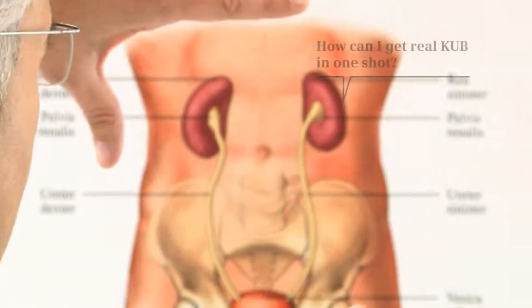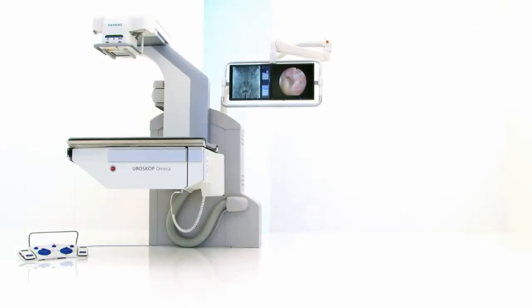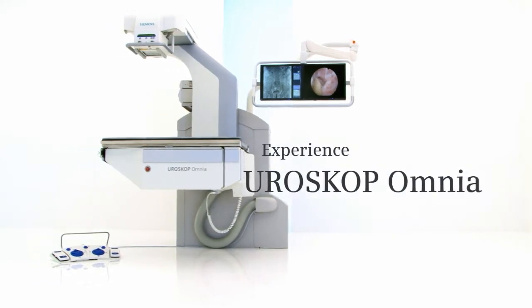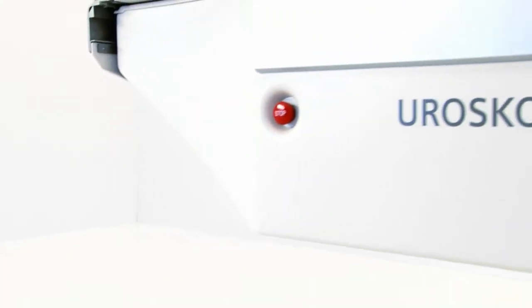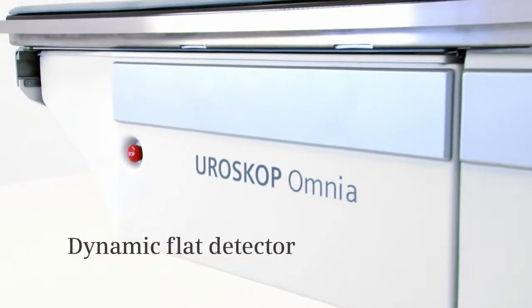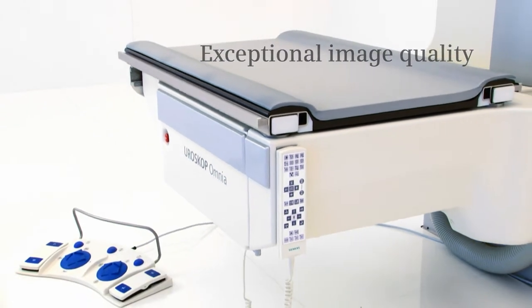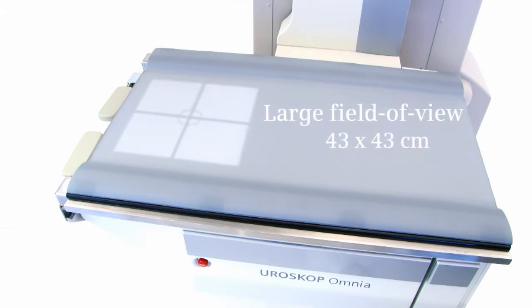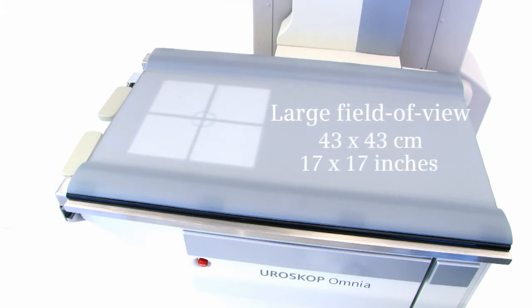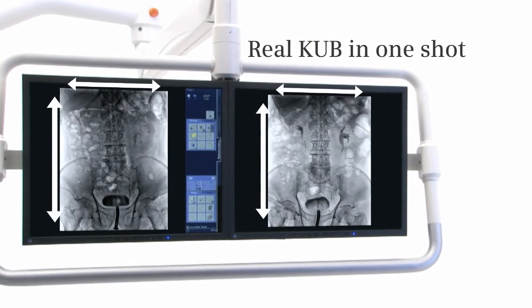How can I get a real KUB in one shot? Experience Uroskop Omnia. Uroskop Omnia features a dynamic flat detector for fully digital imaging with unmatched image quality. Thanks to a large field of view with 43 by 43 cm, or 17 by 17 inches, you get a real KUB image in a single shot.